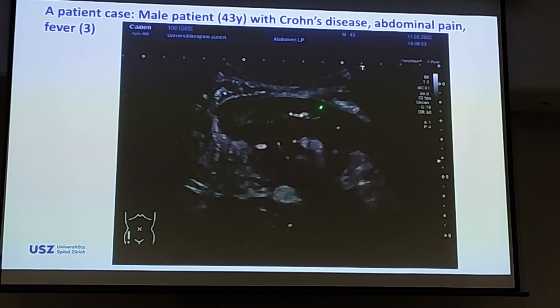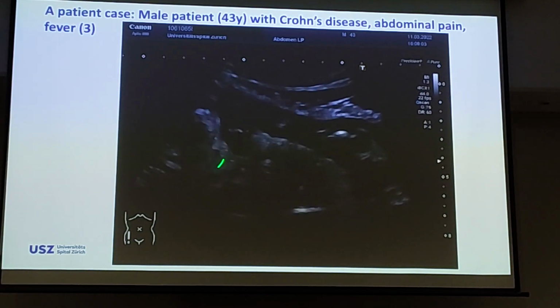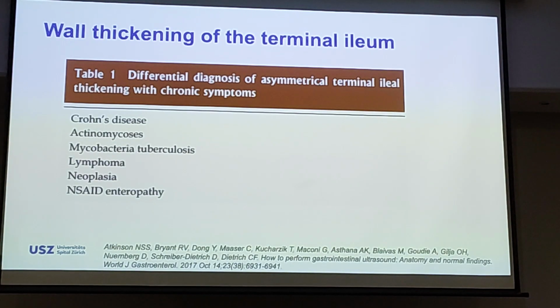That completely lost stratification, indicating the inflammation, and here you see the large abscess or several abscesses. Here's one, with gas bubbles inside. So this guy has an abscess, has several abscesses. Despite not having a lot of symptoms, we got the result right away. We called our surgeons to see the pictures, and he was referred to surgery, to resection.